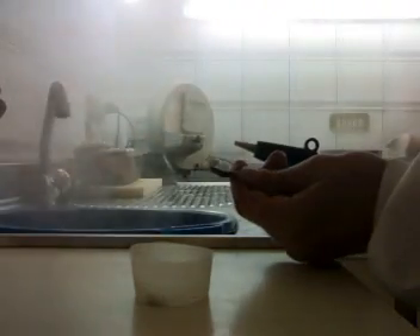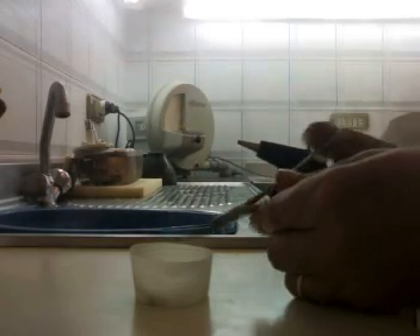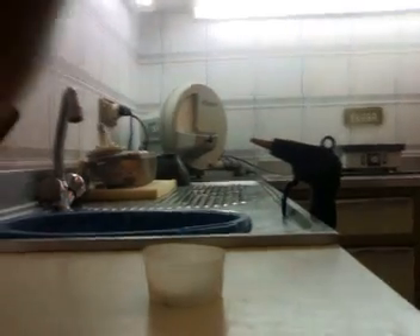Now my crowns are nice and clean and ready to be glazed.